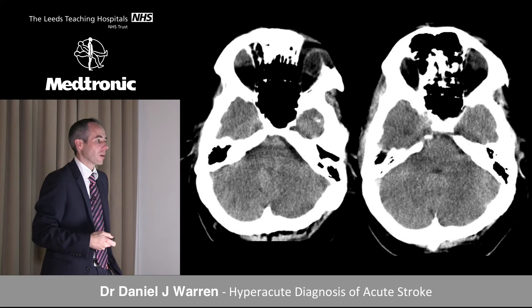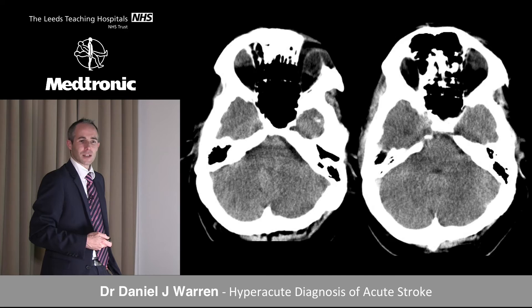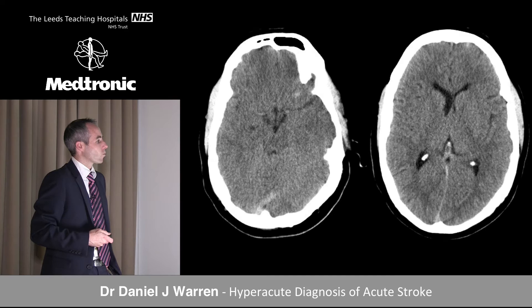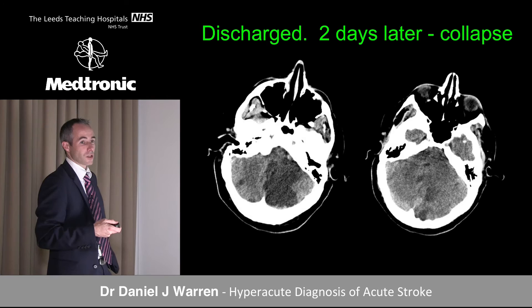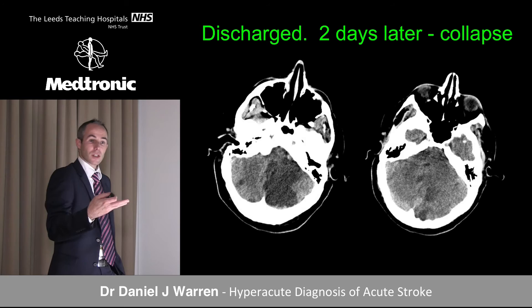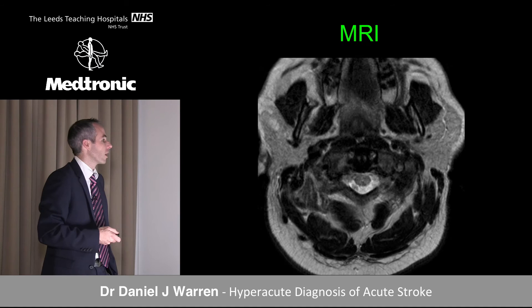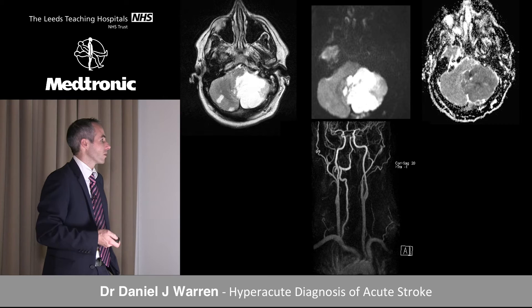Sometimes you walk past things because you don't look for what should be there. The fourth ventricle should be a well-defined rounded structure — here you can't see it. Grey-white differentiation is present in one hemisphere but not the other. Higher up, the basal cisterns are partially effaced. The scan was considered normal and the patient discharged. Two days later they returned: the infarct had matured, the fourth ventricle was further effaced, evolving hydrocephalus had developed, and MR confirmed vertebral dissection with a large posterior territory infarct.